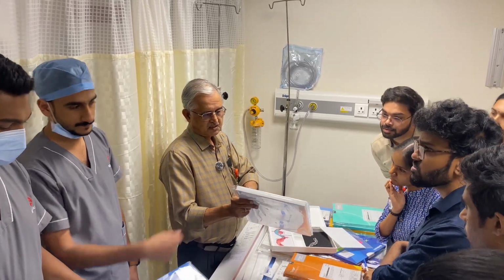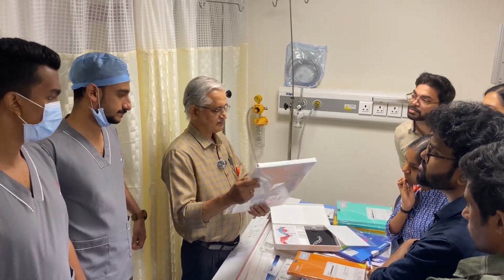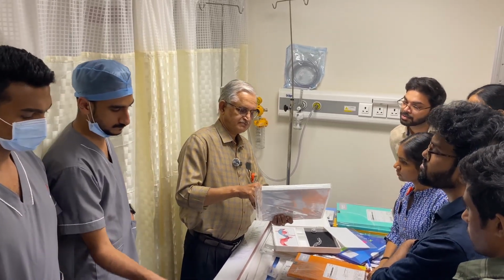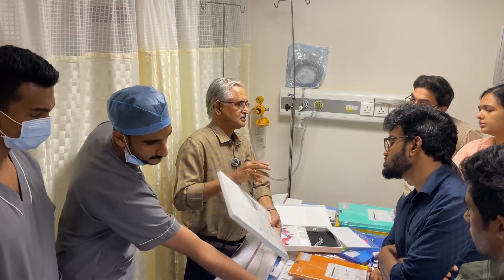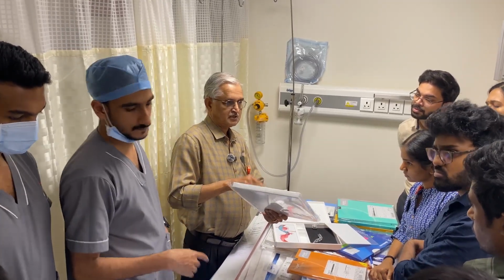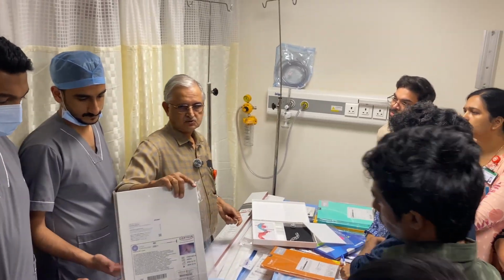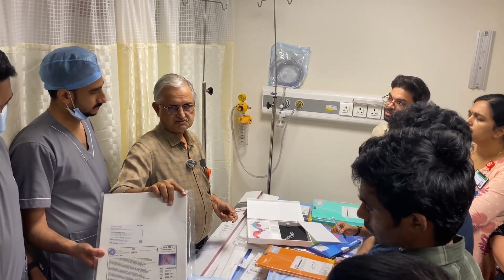It's called something like a vascular plug device. It's already made up, a contoured thing. When you deliver it, it will open up like this, and it will go to the different parts of the aneurysm.